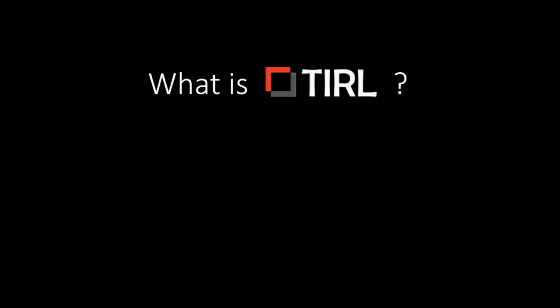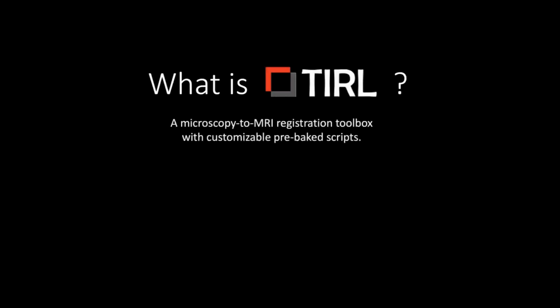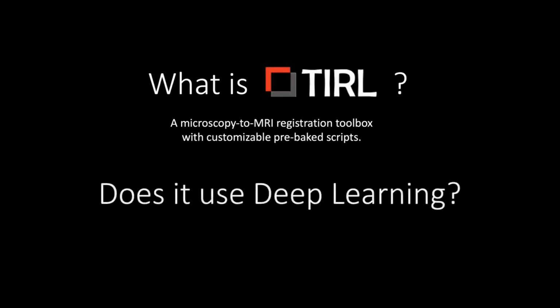So what is TIRL? It's a microscopy to MRI registration toolbox with customizable pre-baked scripts. Does it use deep learning? No, until you implement your own extension, because it's designed to be modular and customizable, and it's entirely implemented in Python with some libraries in C just to speed up some processing.